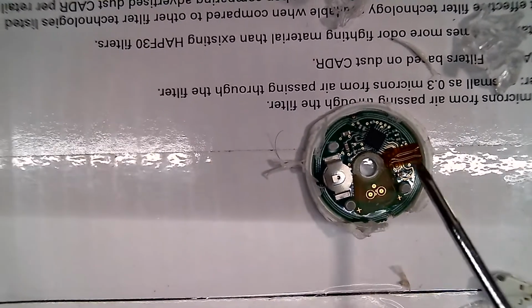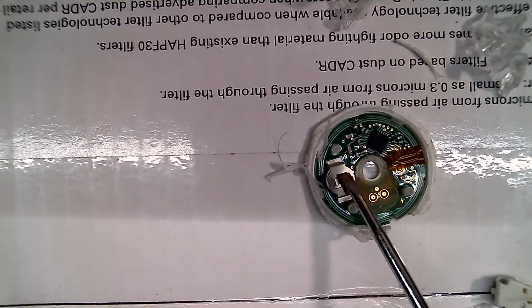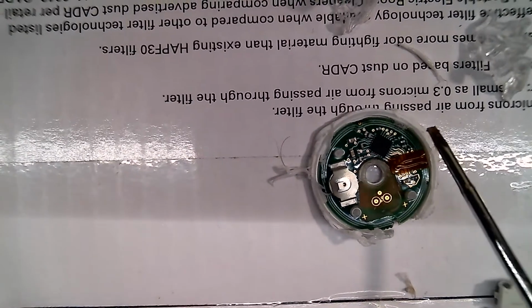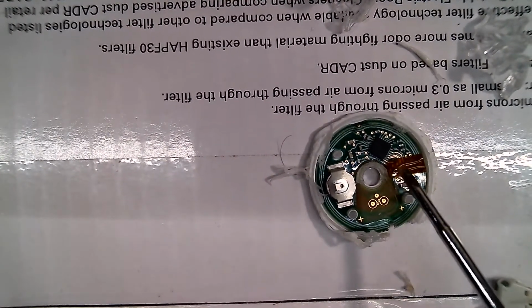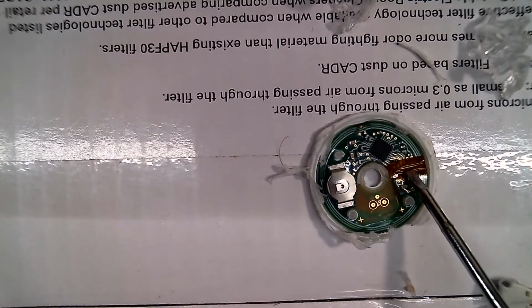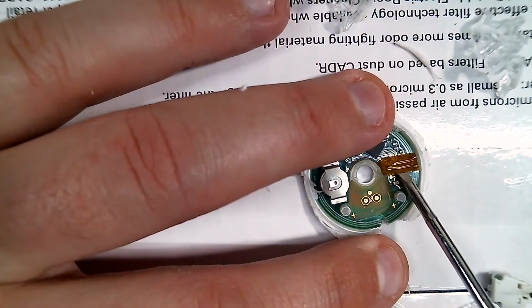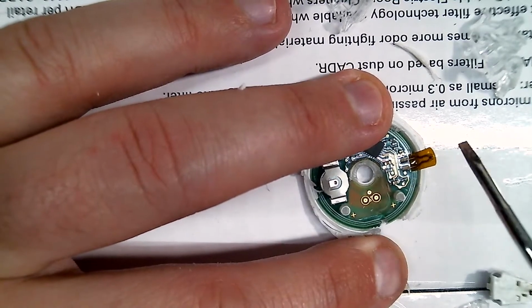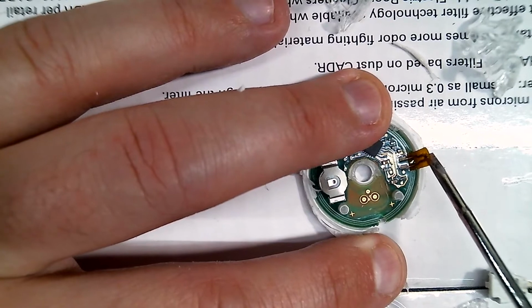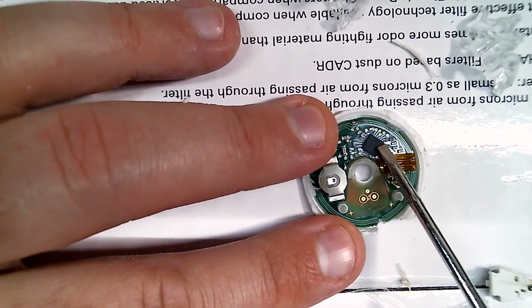So there's definitely some kind of, it's probably not just the RF. Because we can definitely see that right there is probably going to be your RF antenna. Obviously a button cell. Contacts for the sensors. I don't know why these were labeled plus. Looks like passives. Oh no, actually that's something else. Because the antenna for this thing is probably all the way around, so what the hell is this? I don't have a clue what that is. Some kind of sensor. But with the chip in here, you can definitely tell why it was serialized.